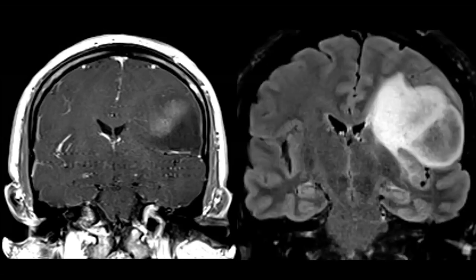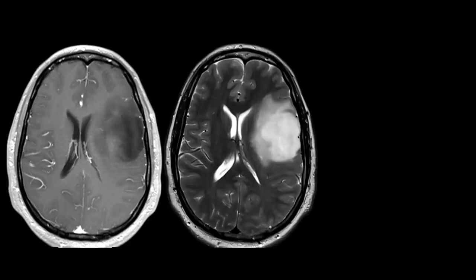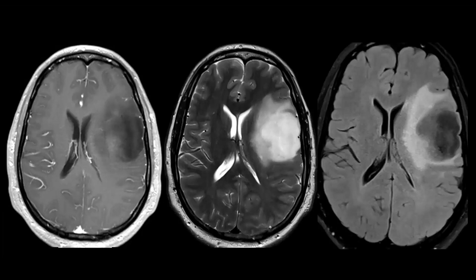All right, let's look at this image. Here we go, look at the coronal. Just as Octavio just described it, would you like to see this exact coronal section in a T2 FLAIR? Sure, thank you. Oh, here it is. Oh yeah, there is a T2 FLAIR mismatch sign. Yes, sir, hang on. T1 post, just looking at this particular cut, little blushy enhancement, T2 FLAIR. What do you think?